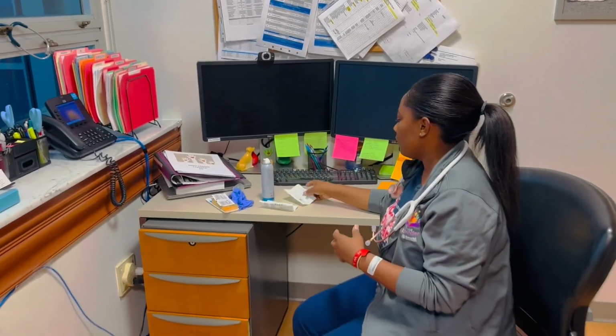So what are the different sites for your subcutaneous injection? Usually the good spots are towards the back of the arm, anywhere there's a fatty area, or you can use the abdomen as well. Those are some of the sites that you're able to use. You always want to avoid any site that has a lot of bruising or a lot of trauma in it. So you just have to look at the patient to make sure that you're using a good site for them. Okay, so what are some of the things that you're going to need?